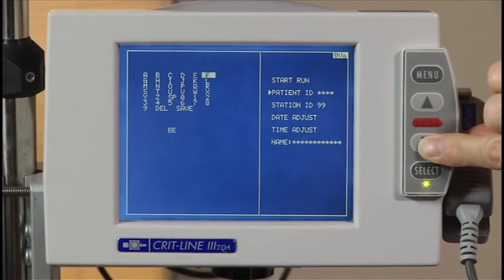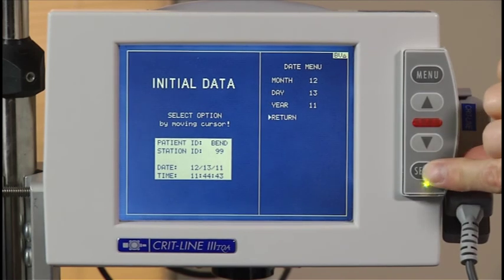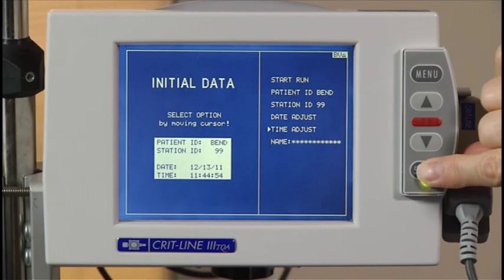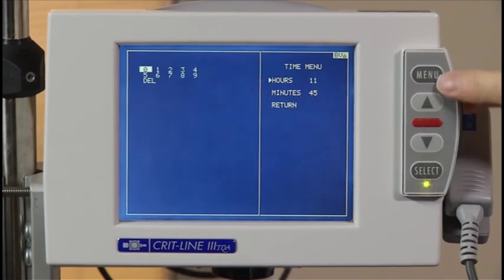To change the date, scroll to date adjust and press the select button. You can then scroll to month, day, and year in order to enter the correct date. To change the time, scroll to time adjust and press the select button. You can then scroll to hours and minutes in order to enter the correct time.